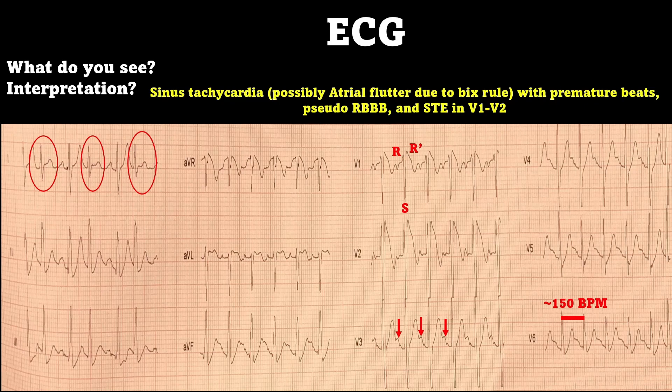Looking throughout this, I see some ST depression in some of your inferior leads and in V5 and V6. There's also ST elevation in V1 and V2, and a little bit in AVL. I believe the ST depression is rate-related ischemia because the patient's heart rate is going so fast. The ST elevation in V1 and V2 — giving you that pseudo right bundle branch block — has somewhat of a coved appearance. So this is a sinus tachycardia, possibly atrial flutter with premature beats, a pseudo right bundle branch block, and ST elevation in V1 through V2.